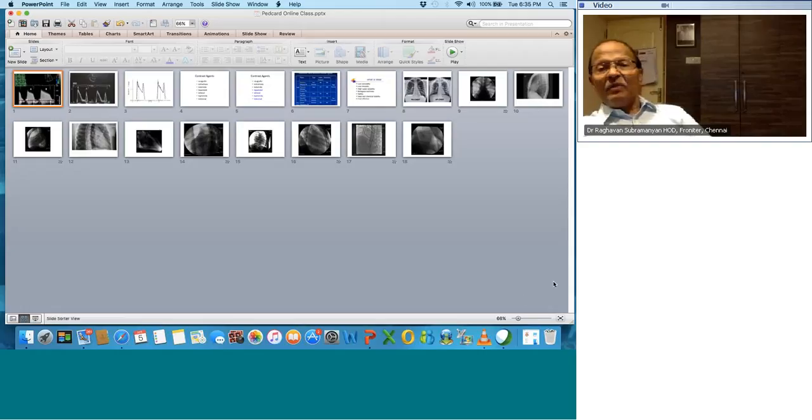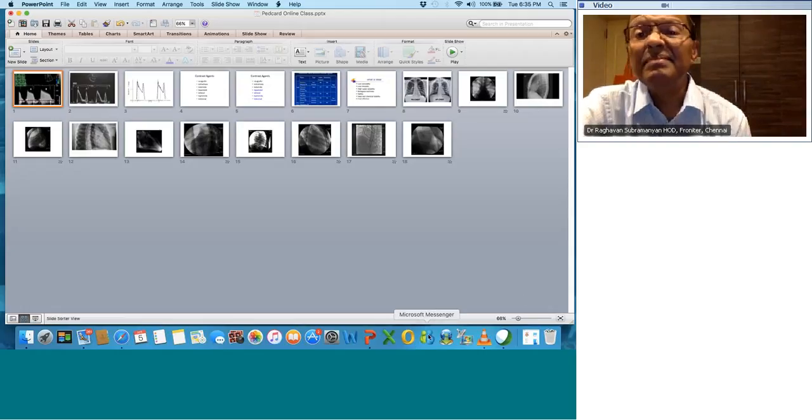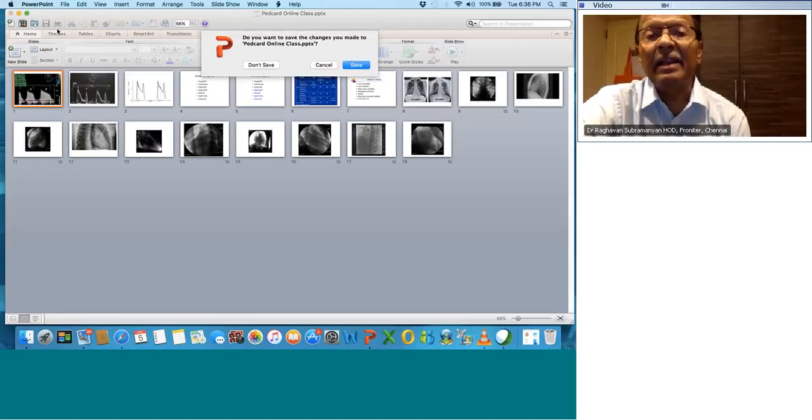Okay, Kavita, do we have time or is time over? Well, I think we are running short of time. I'll just show you one more angio, just an echo recording for interest, and then we'll wind up.